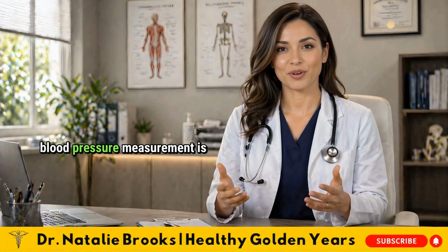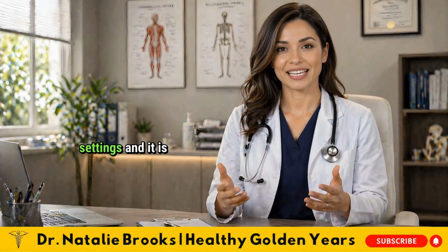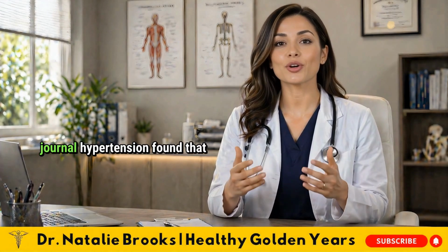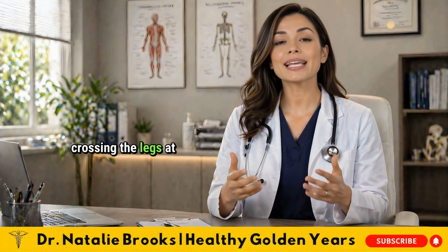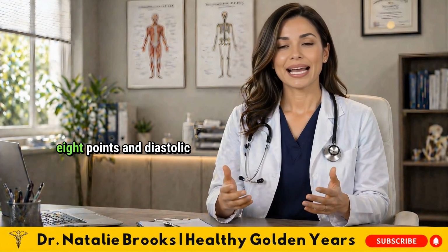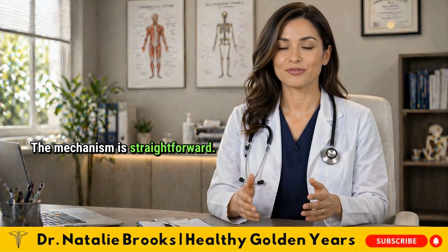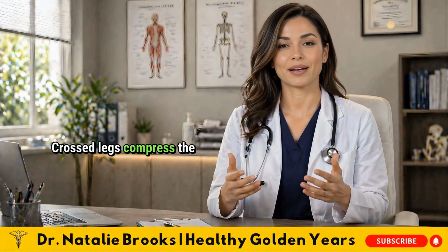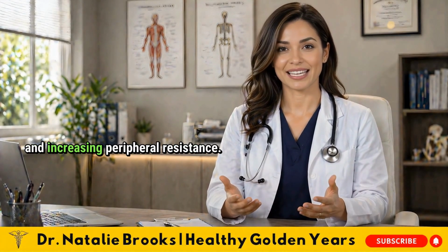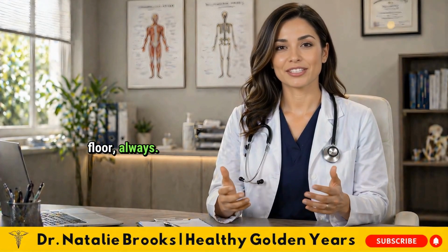Crossing your legs during blood pressure measurement is one of the most common errors that doctors themselves make in clinical settings, and it is well documented in medical literature. A study in the journal Hypertension found that crossing the legs at the knee during measurement artificially raises systolic blood pressure by 2 to 8 points and diastolic by 3 to 8 points. The mechanism is straightforward. Crossed legs compress the blood vessels in the lower limbs, redirecting blood volume upward and increasing peripheral resistance. Feet flat on the floor, always.